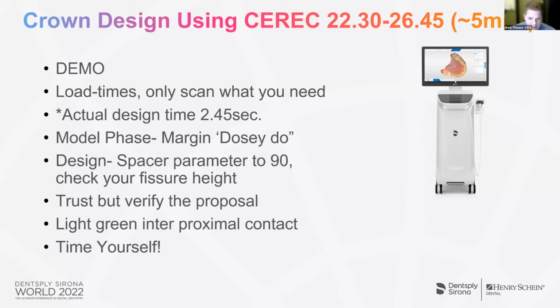But as you get better with the computer, you'll find more and more you're getting all the proposal done just there on the computer. Just make sure you really want to challenge yourself. Don't take too long on those designs. On this case, my actual design time was 2 minutes and 45 seconds. So from the time I scanned the patient until I got that to the mill is 2 minutes and 45 seconds. So it can be done.